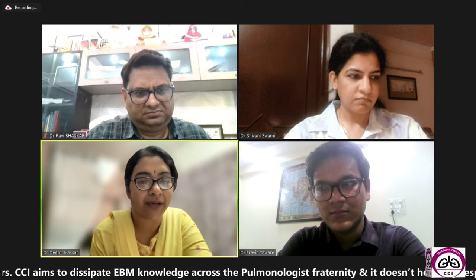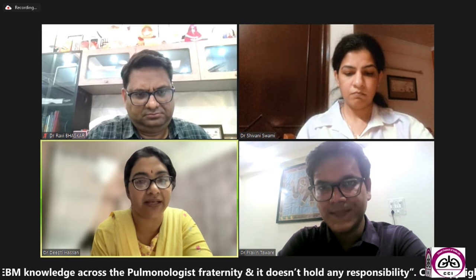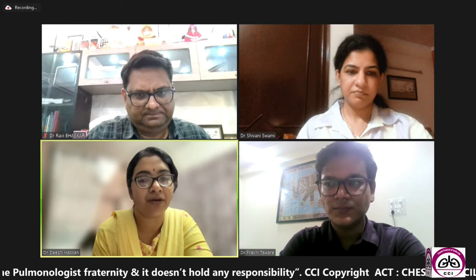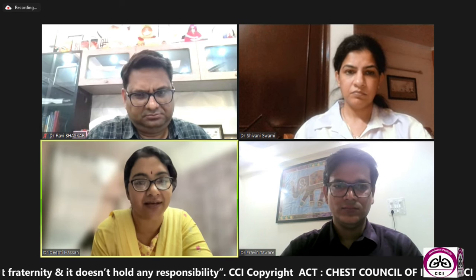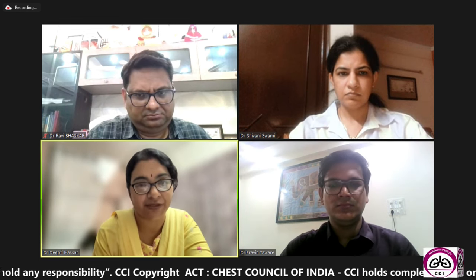So how it is going to help is, number one, whether they are taking it on time, whether the patient is regular with the medication. And number two, it can help to detect any triggers. Depending on which place they have been forced to take that inhaler, they can work up the trigger which could have led to the exacerbation.